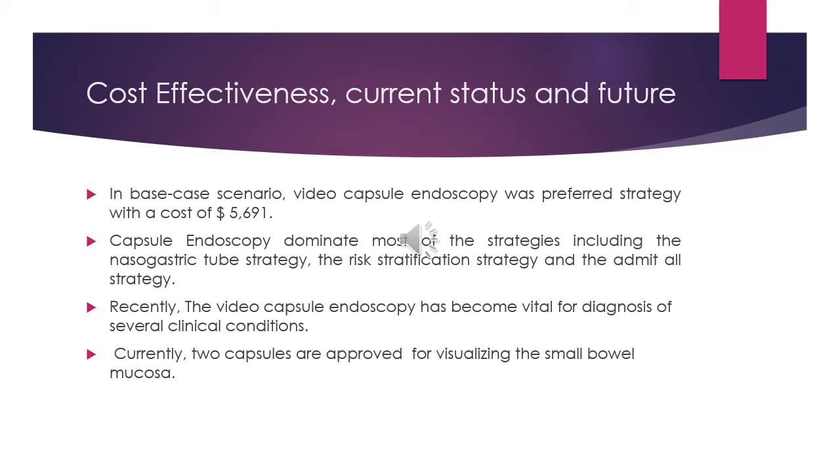Currently, two capsules are approved for visualizing the small bowel mucosa. One capsule is authorized for esophageal assessment, and several others are in use or under evaluation worldwide. New investigations have focused on optical improvements, advances in intestinal cleansing, and risk reduction strategies to optimize video capsule endoscopy methodologies in clinical care.